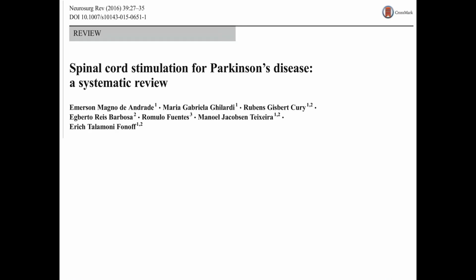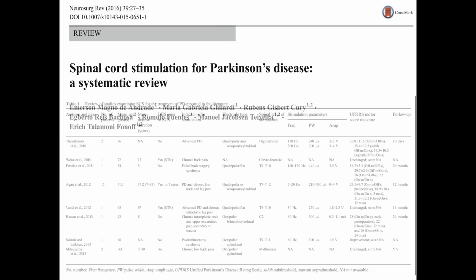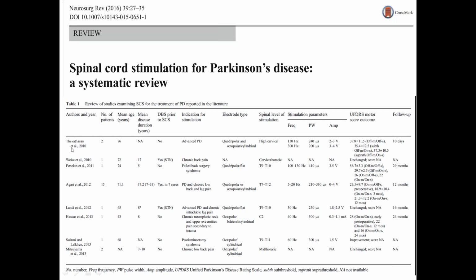This was a review that was done in 2016, and it showed these are the different case studies, these different authors in different years, so all done just after 2010. Only 2 or 1 patients were done. This was the Tokyo study. They did 15. That was the most that's been done.